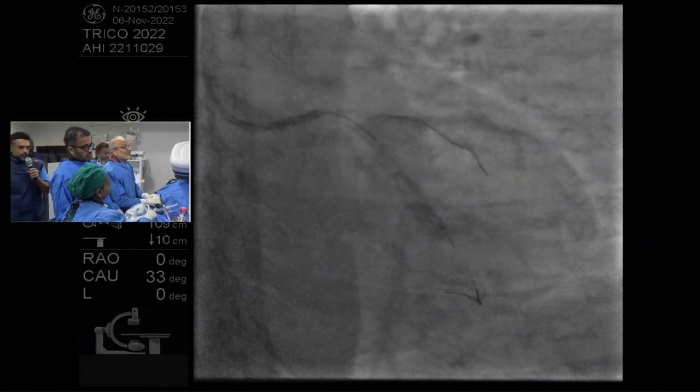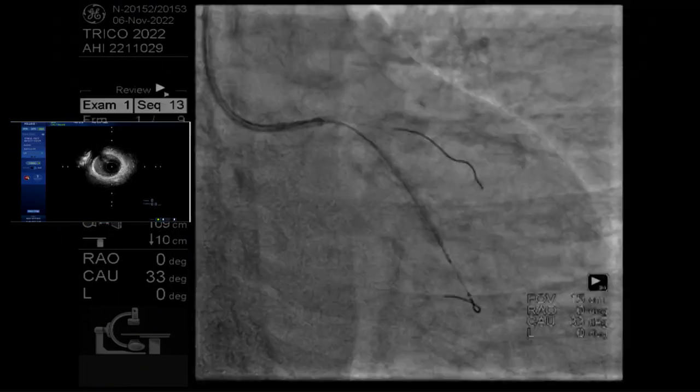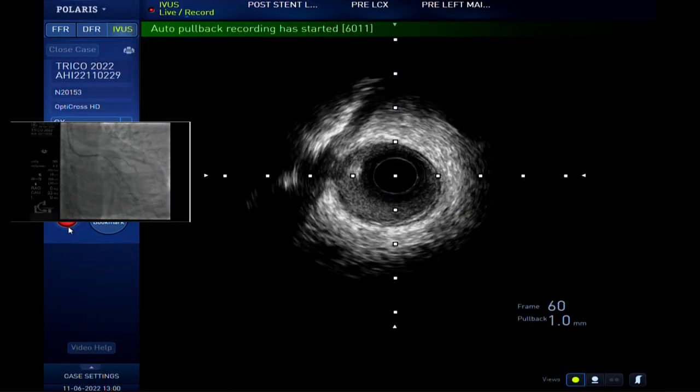Because there were many of those patients that were femoral, right? So just Cine again. There, that's just a document, and pull back. So let's look at our distal edge. So this is all very normal vessel.